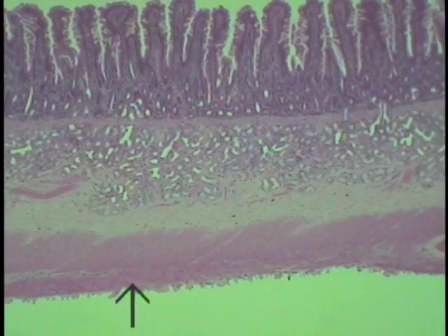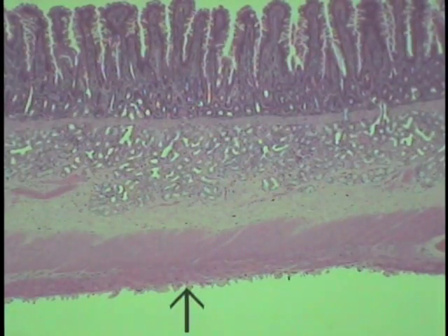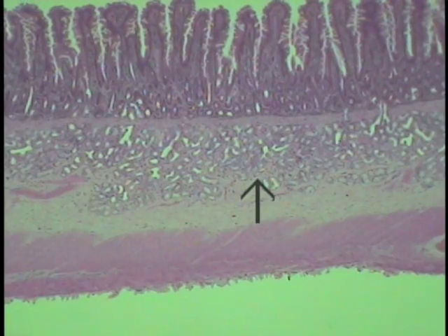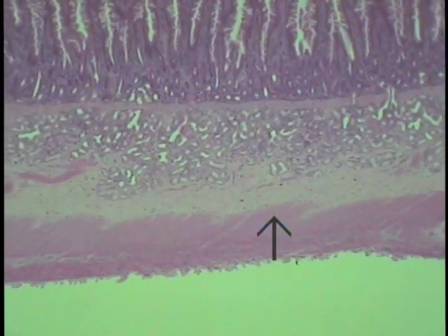And this is perhaps the more distal edge of, or end of the duodenum. It appears to be limited by its fourth and final layer, a serosa. Now also, please do recall that the submucosa throughout the alimentary canal, beginning at the esophagus and going all the way to the anal canal, is going to contain elements of Meissner's plexus, these parasympathetic neurons in that particular ganglia that lie in this area. And the same is true wherever smooth muscle is found.